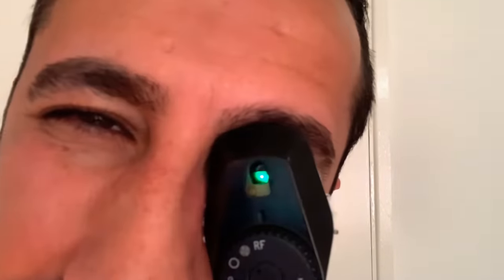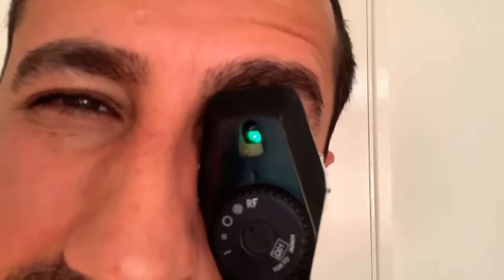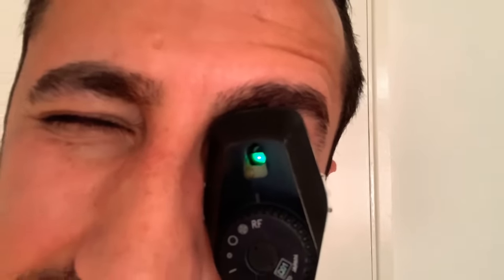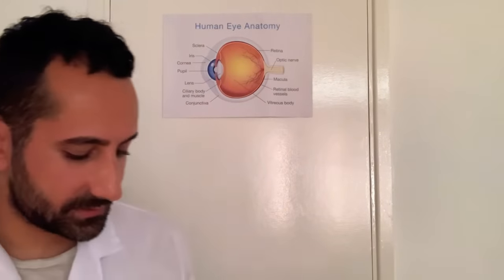And the red free portion. Okay, now look straight. Good. Vessels are fine. No nipping, tortuosity. Excellent. Okay, so that concludes the ocular assessment. Pleased to say everything looks fine there. Let's just record the results. Periphery clear. So there's no retinopathy, no optic nerve head pathology, and the vessels look fine. No signs of any hypertensive retinopathy.